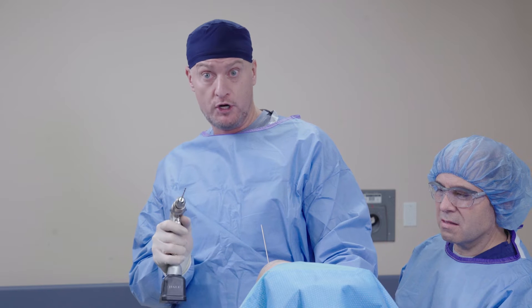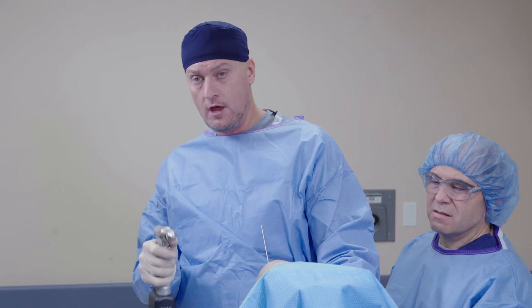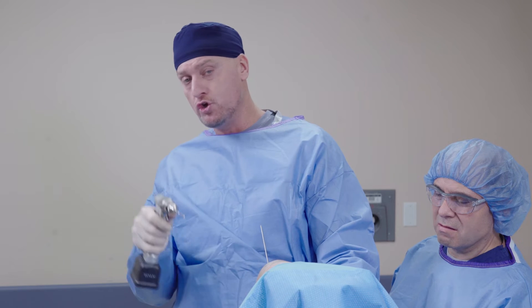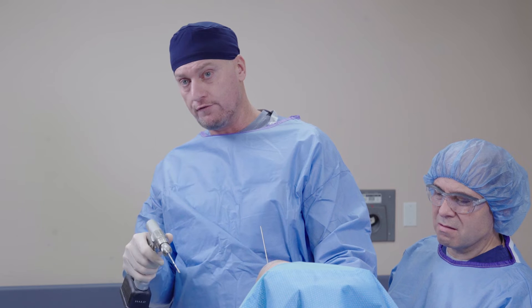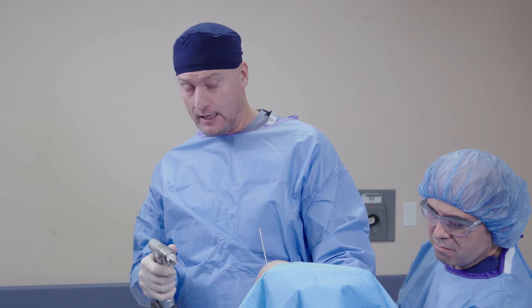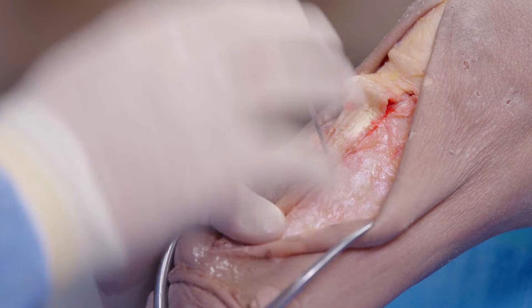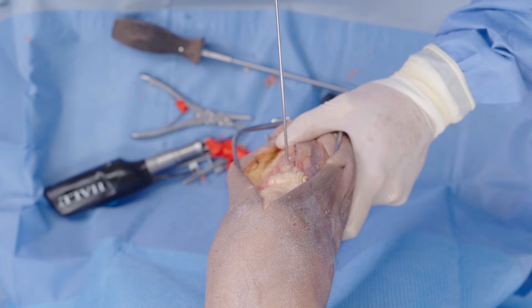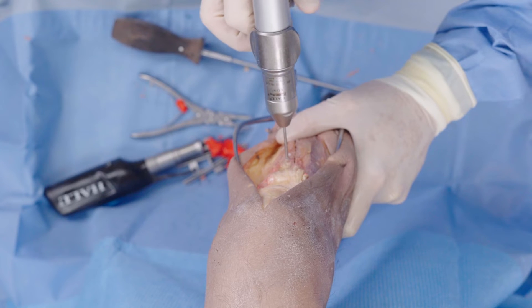If you ever feel like you need to repeat putting your screw in — say you've stripped the screw or didn't measure correctly — a real benefit of utilizing the osseofiber is that you can actually drill through it. So if we ever have to repeat things, it's very easy. It's not like you have to take metal out. Now we're going to remove our provisional K wire and do the second screw.